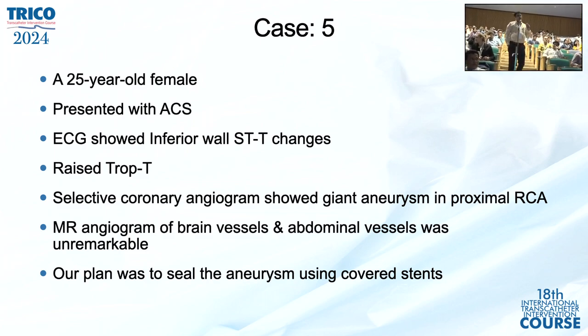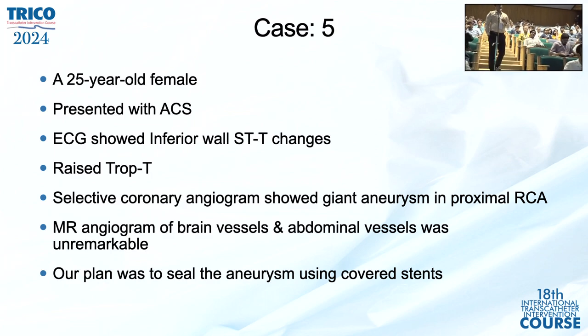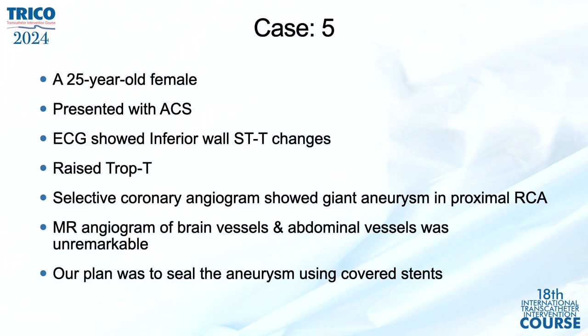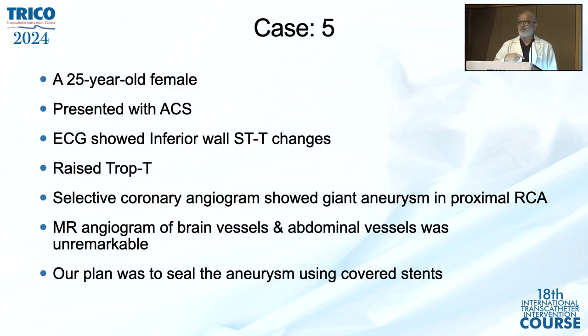But in this case, you can understand, even the 6 French guide was full, I had to remove it. I agree, but I don't know, with that crowding, how effectively I can do it. I have never tried this, but because you already are doing this technique to cannulate, I will remember this. It was totally an artery. I could have used 7 French and then another 6 French inside. Most of the times it is not possible, but in this case, yes, it could have been possible.